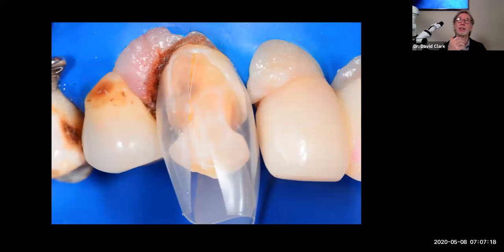But if a patient walks in and they have a broken tooth or a tooth with failing restorations, cracks, incomplete fractures, and the tooth needs to be re-restored, if a crown would have been a reasonable choice in a traditional practice, like that tooth we showed with the incomplete fracture of the mesiobuccal cusp, a total Bioclear overmold case like that, where we're upgrading the dentistry and putting a tooth into compression that was cracked. That's different than first time decay for sure. So what would I propose to that patient? Here's how it works. I say, your tooth is cracked.